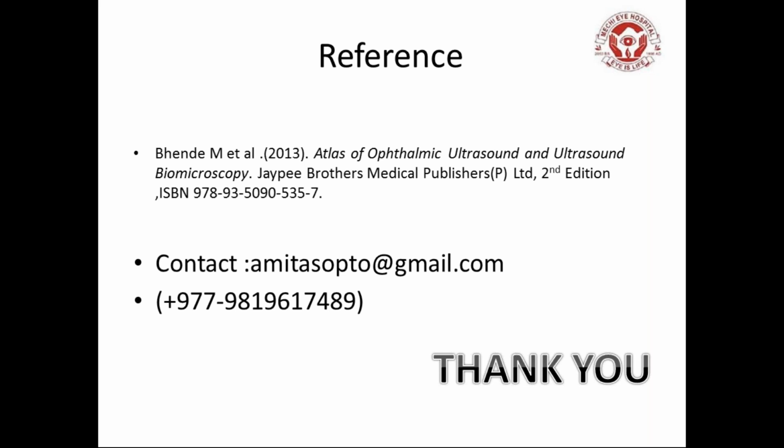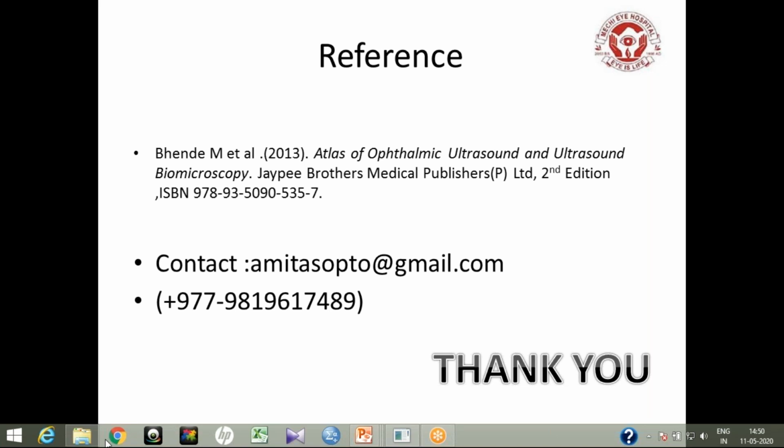Let me check some of the questions. So there is one question: how to interpret intrinsic tumor vascularity? Sorry, intrinsic tumor vascularity, sir. Is there any case?